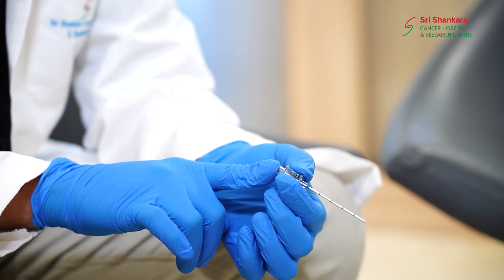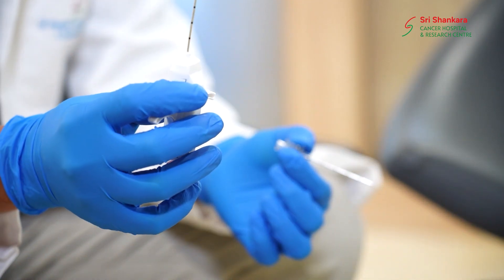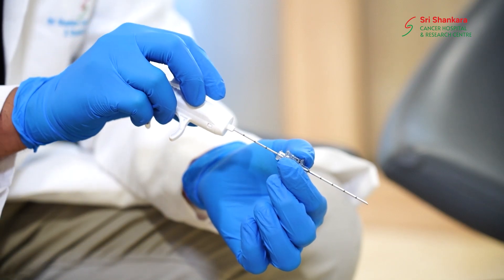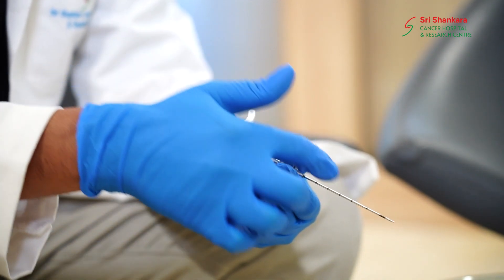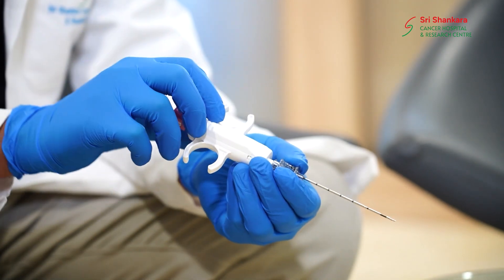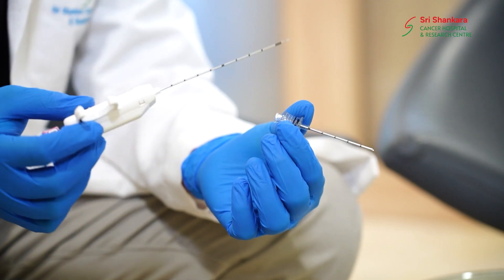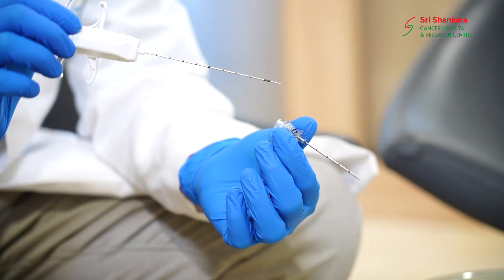The needle is hollow here. This is the semi-automatic biopsy gun and I can pass this semi-automatic biopsy gun through it. Once I pass it, the end comes out into the abnormal tissue. That is the use of this coaxial — the main thing is this is a single puncture.